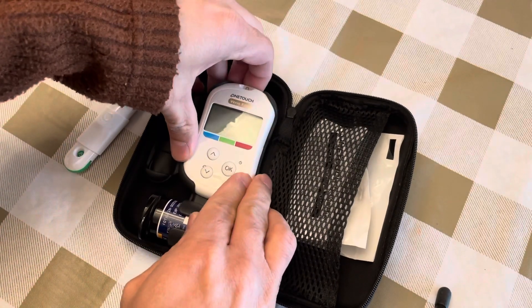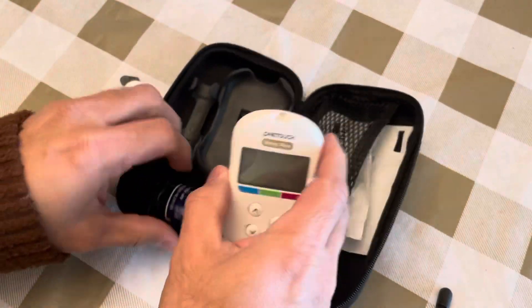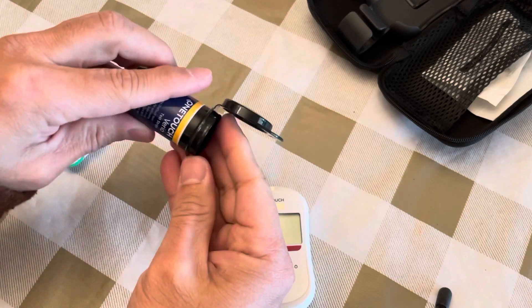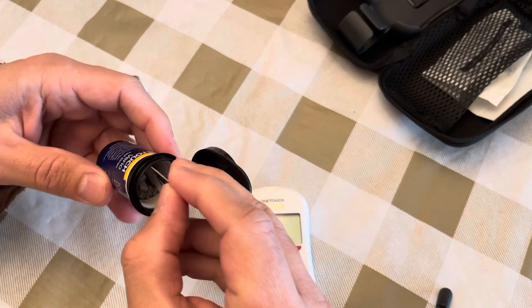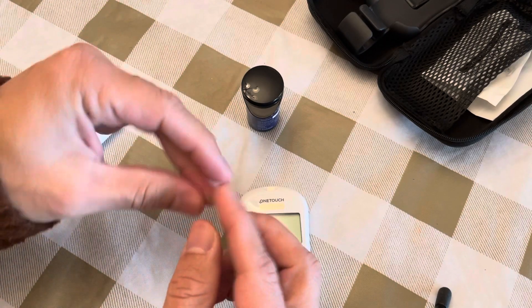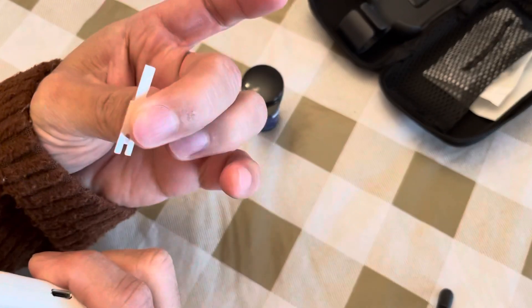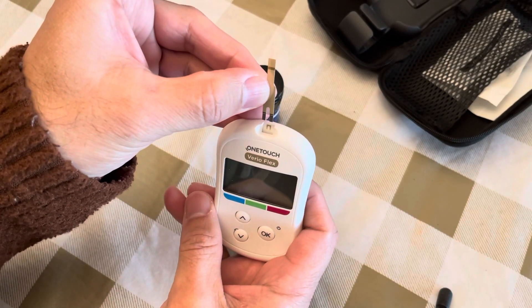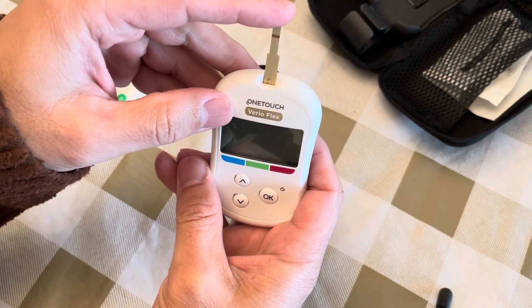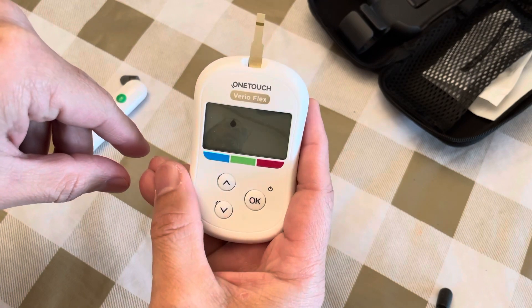Now get the glucometer ready. These are the strips — you have many because you test before breakfast, after breakfast, before lunch, after lunch, and before and after dinner depending on your situation. The strip has a gold-plated side and a white side. Make sure the gold-plated side faces you, then insert it and the meter will turn on automatically, waiting for blood. The blood drop icon means it's ready.